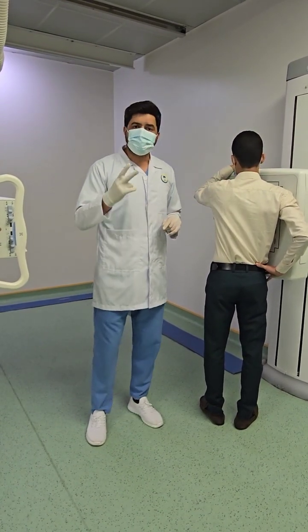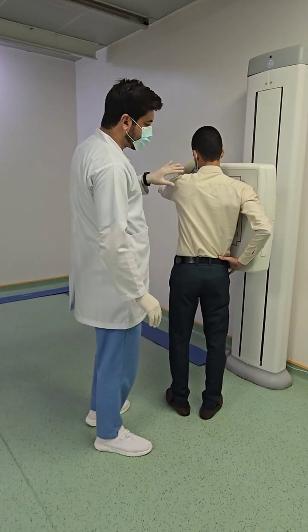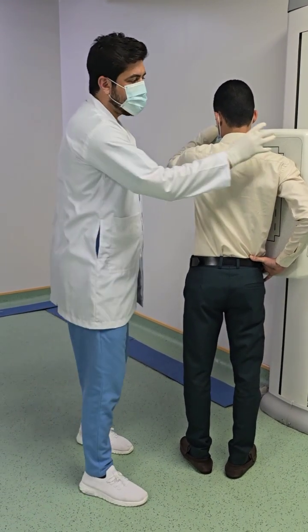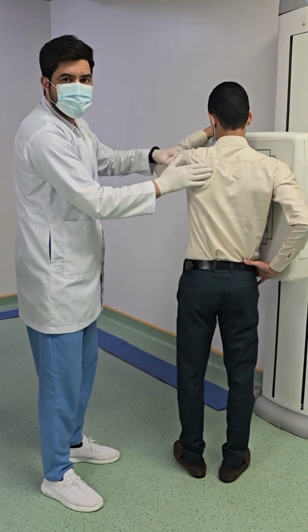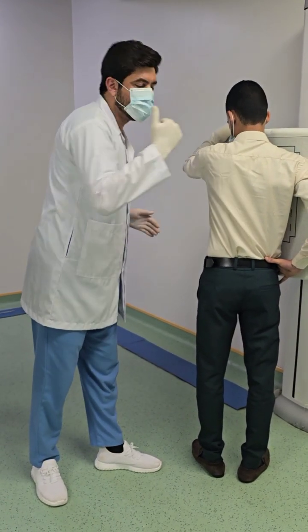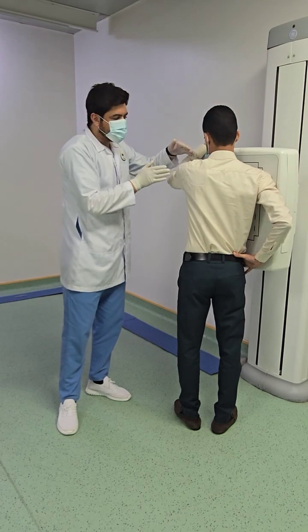In the anterior oblique, there are two views. One is right anterior oblique, the other is left anterior oblique. Now, see, this is the left side of the body, this is the right side of the body. And the anterior side of the body is near to the detector. The right side of the body is attached to the detector, and the left side is far away from the detector. We will take the side of the body which is near to the detector. First, anterior is near to the detector, and the right side is attached to the detector. So right anterior, and the patient is not in the anterior position, it is in oblique view.